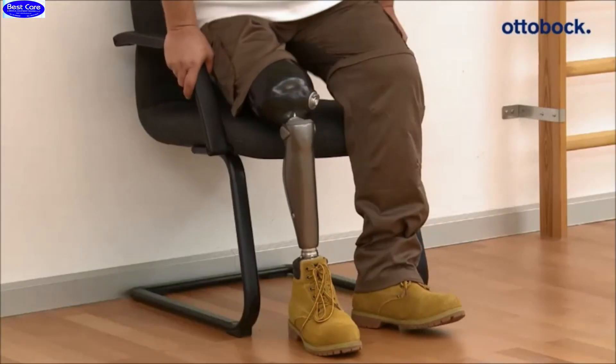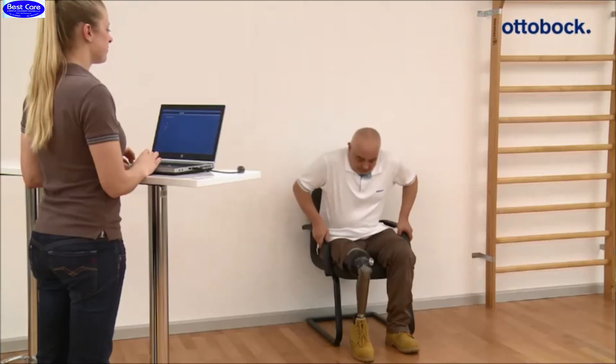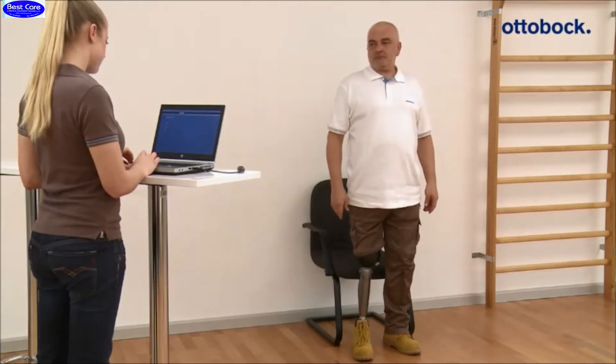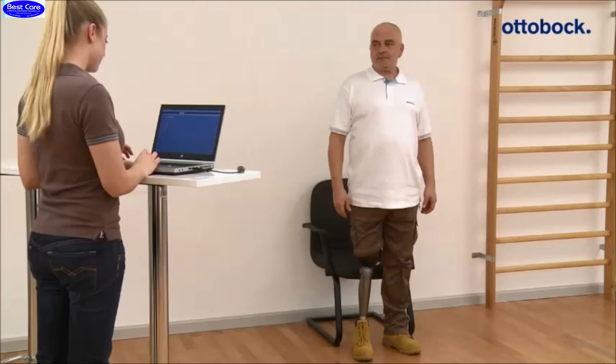First, the adjustment stance flexion resistance is checked while performing a sitting down movement. The patient should be able to load the prosthesis while sitting down. The flexion velocity should meet the patient's need. The value can be adjusted via the adjustment software.